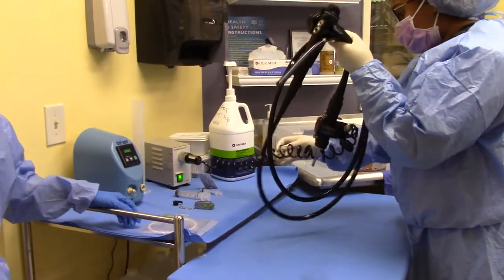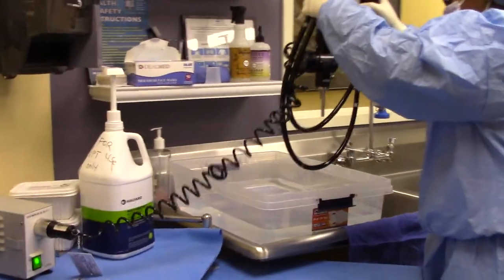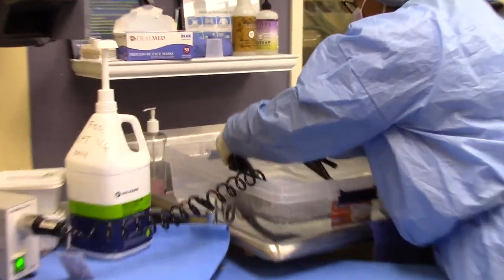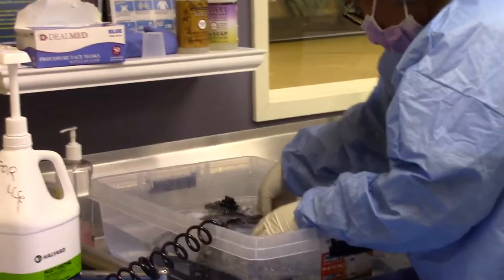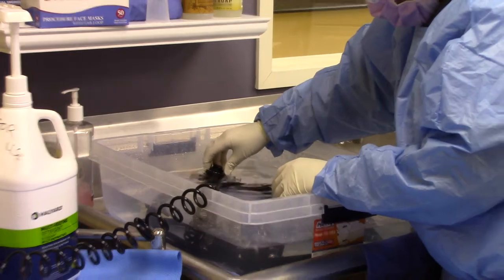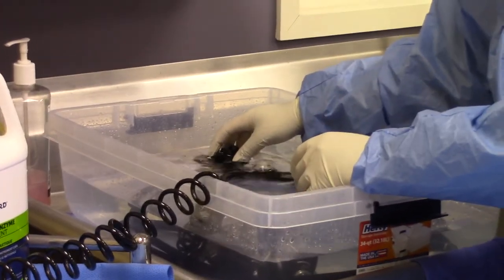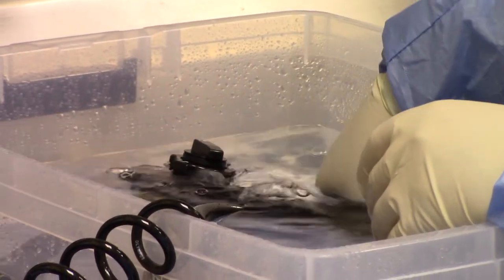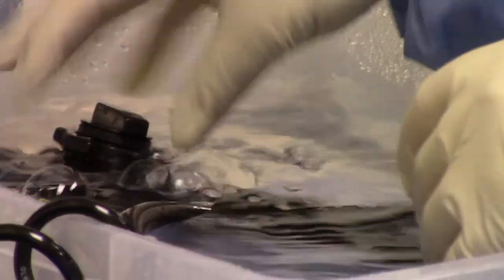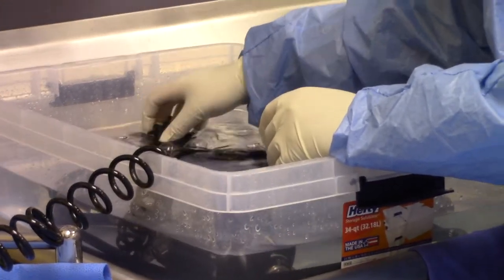Next, she is moving the endoscope into a clean basin filled with water. This is to show that there are bubbles coming out of the endoscope. If there are any bubbles coming out from areas that aren't meant to, that means there is a leak in the endoscope. But if there are not, the endoscope will properly pass the leakage test.